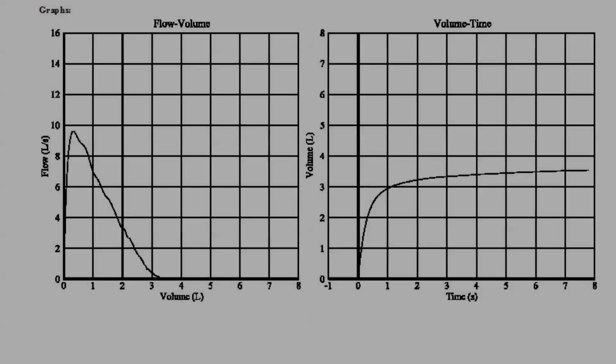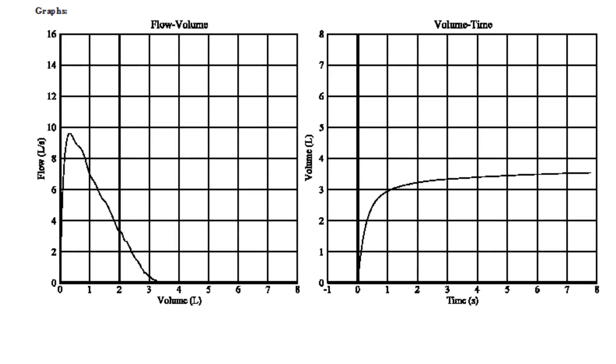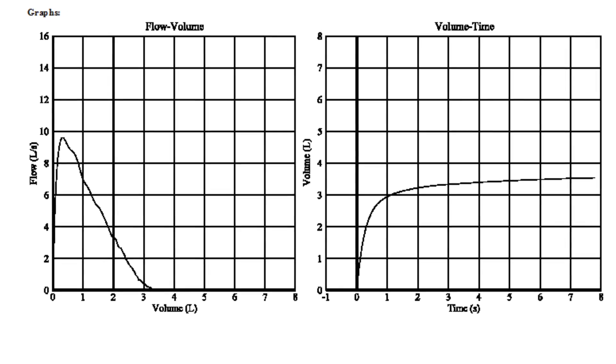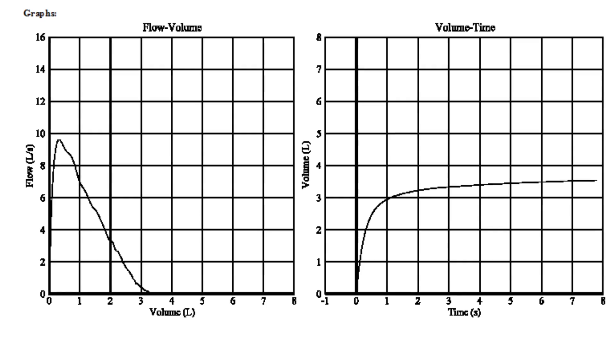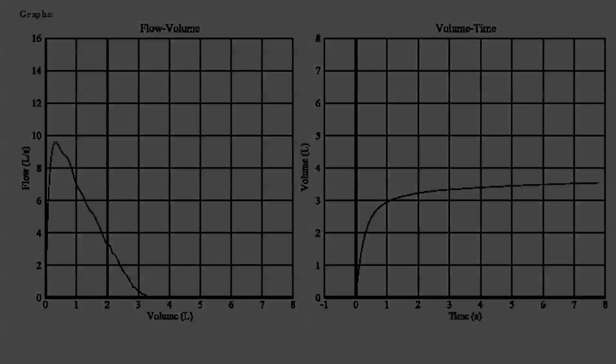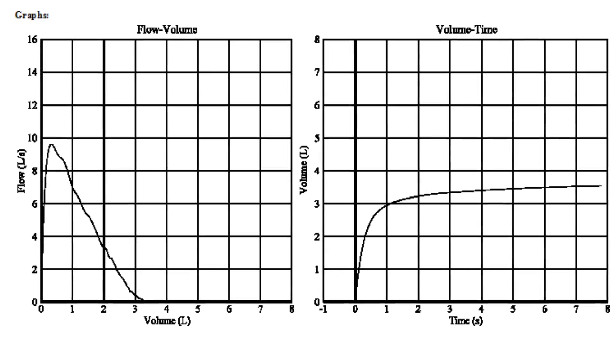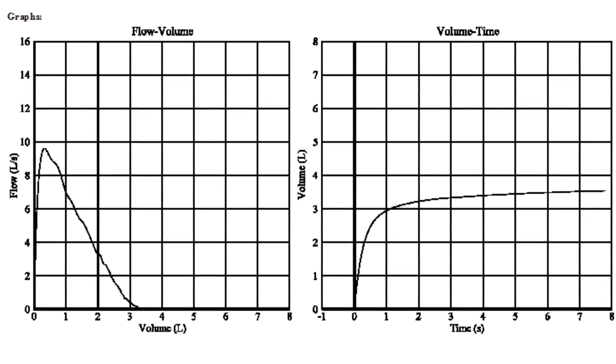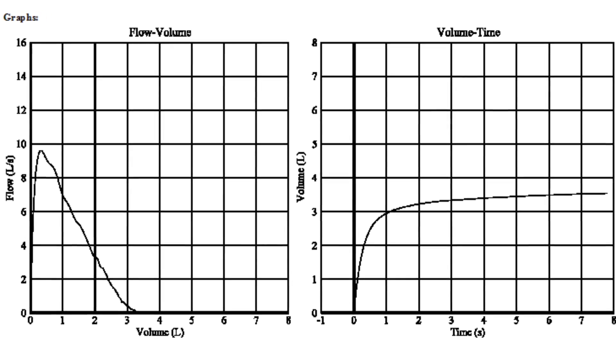A spirogram is made up of several individual maneuvers, and these maneuvers are represented on both a flow volume and a volume-time graph. There are also many ways to plot the curves on a graph.